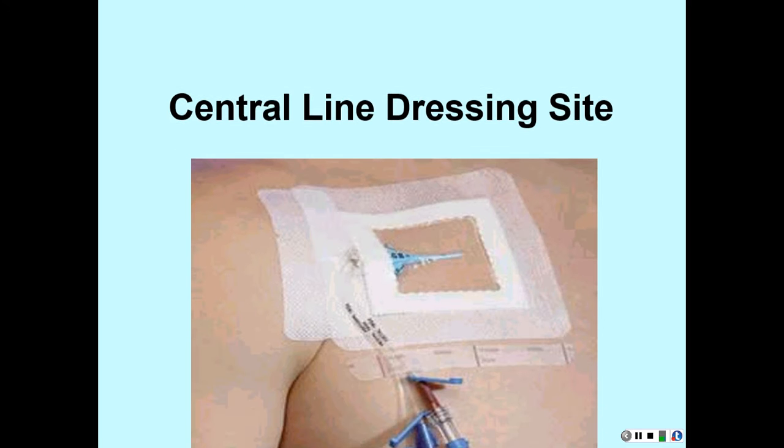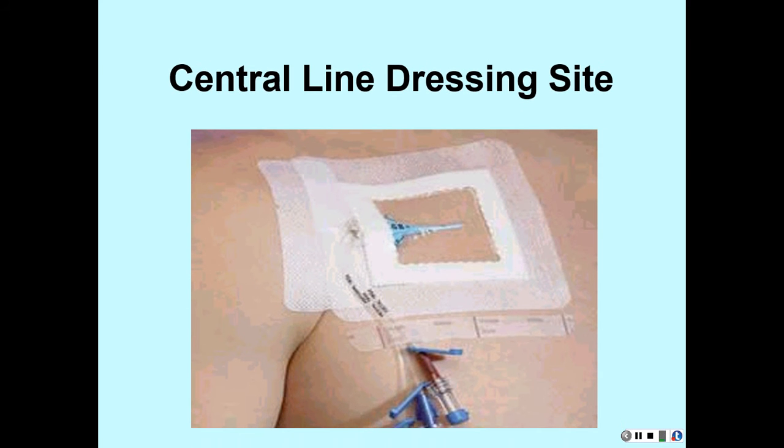Your central line dressings are usually changed every other day. They must be covered by a Tegaderm or Opsite. And it is a sterile procedure when you do dressing changes on a central line. You guys will do this in 201.